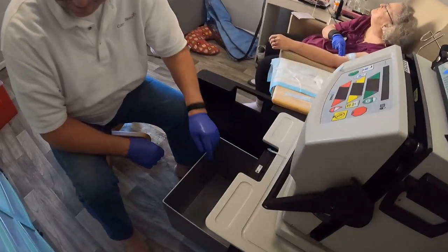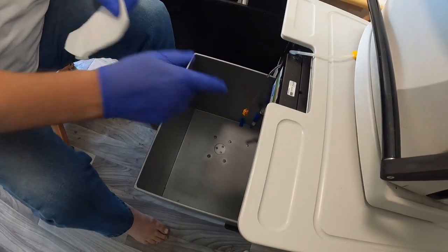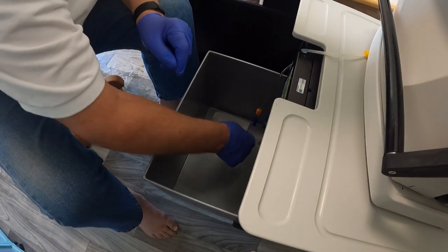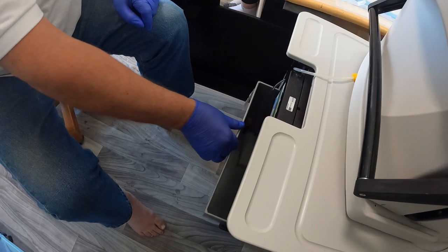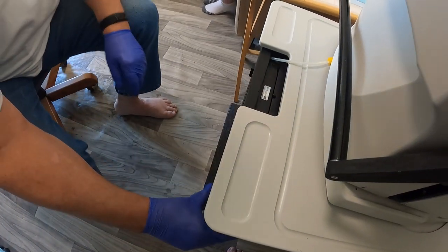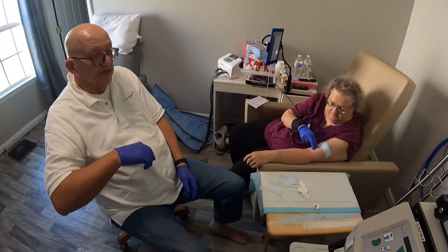You see at the bottom? That's a moisture sensor. So if it gets wet in there, you've got a red alarm here and the whole thing shuts down. So I put a paper towel in here, leave these lines in here just in case. And then when I push this closed, that paper towel catches any water that might drip out of that line. Pretty smart. And then all we gotta do is wait the time for that.